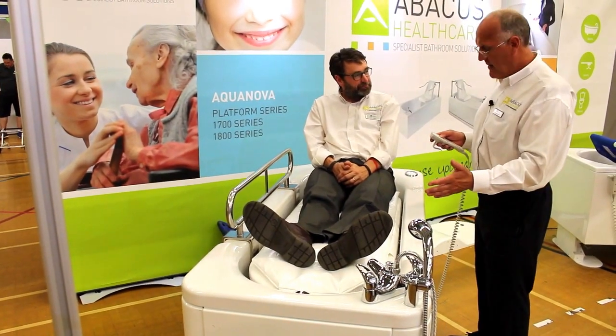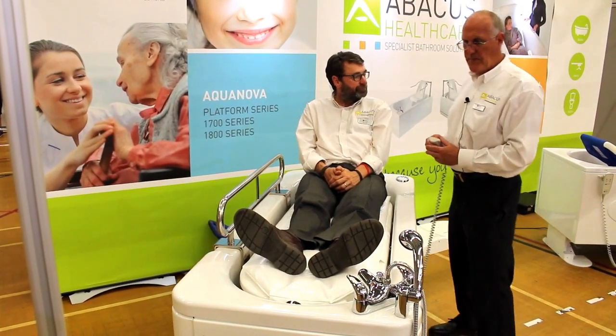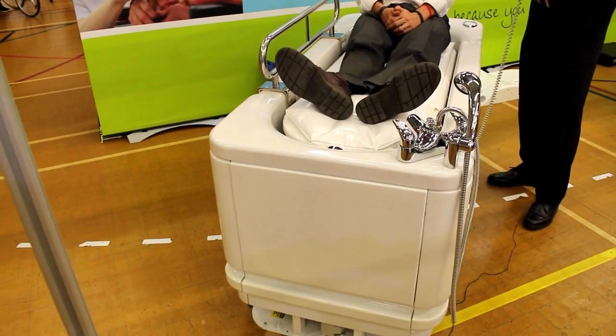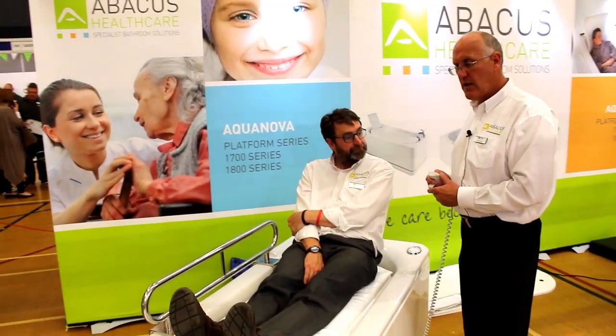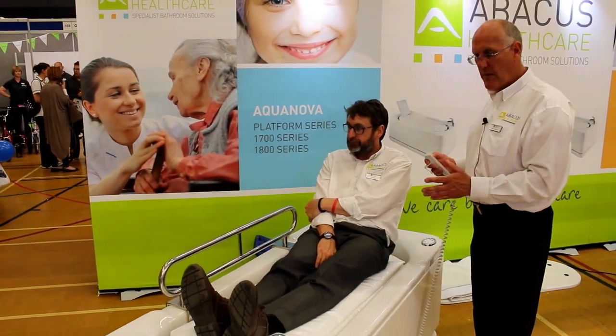Once I've actually dried Bob, I can then reduce the level of the bath so that we can either have a stand-in transfer or again use the hoist to transfer Bob off the top of the platform. The main benefit of all of this is I don't have to move Bob at all in order to finish the operation of bathing, drying, and personal care.